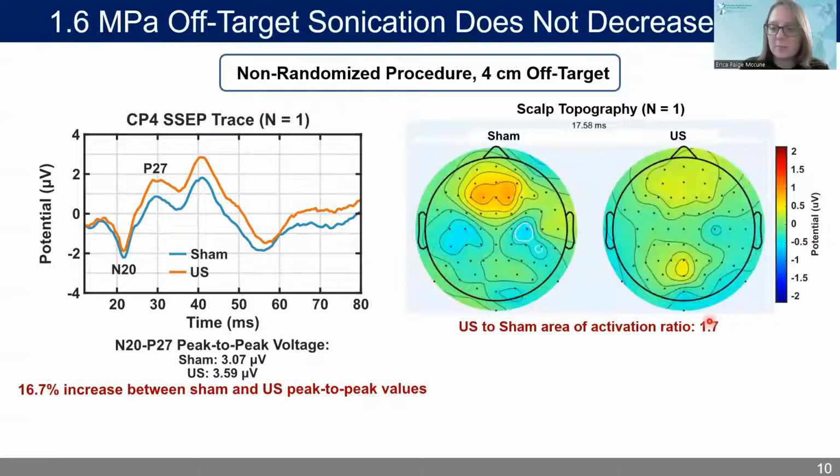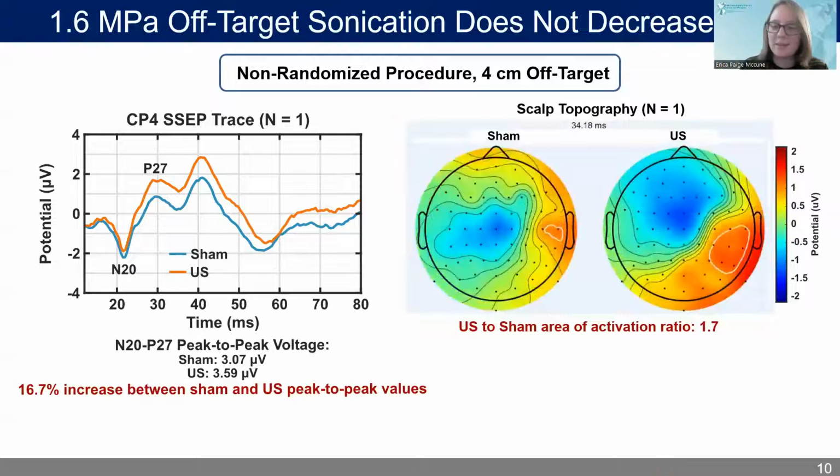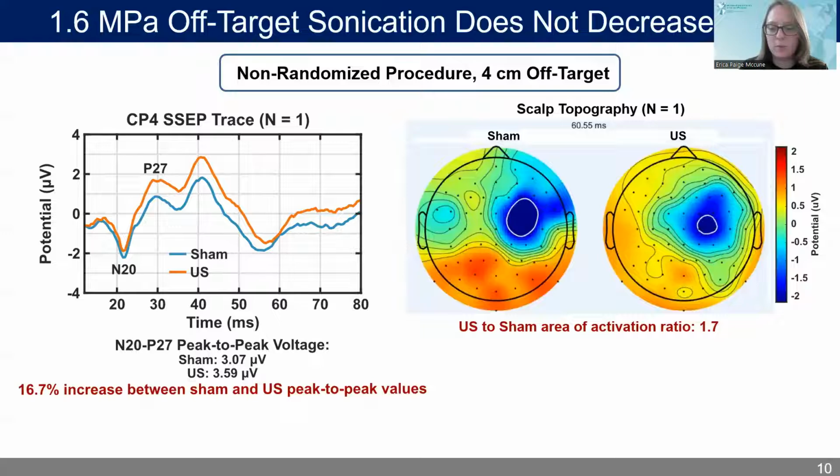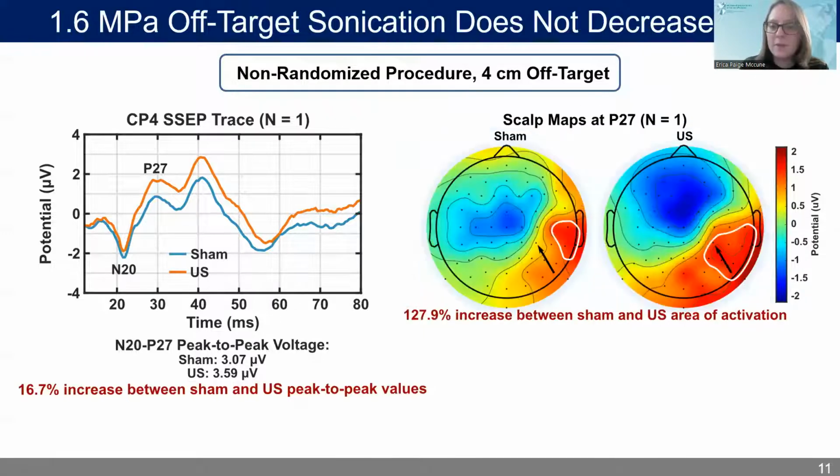When we take a look at the scalp topography, we see a consistent increase in the area of activation with FUS, with a ratio between the two of 1.7. Finally, at the P27 deflection, there is an overall increase in the area of activation in the FUS condition compared to the sham.